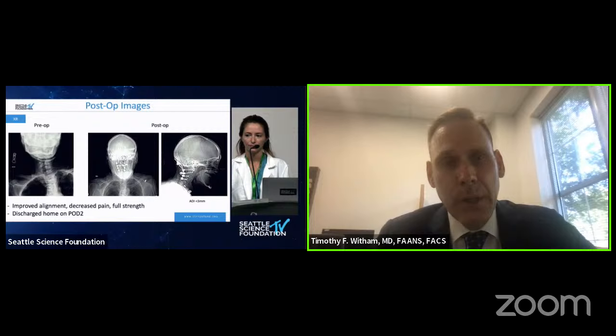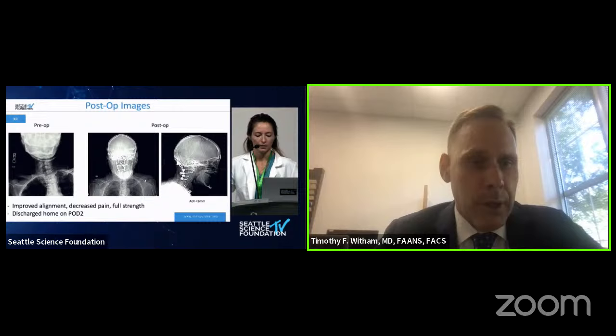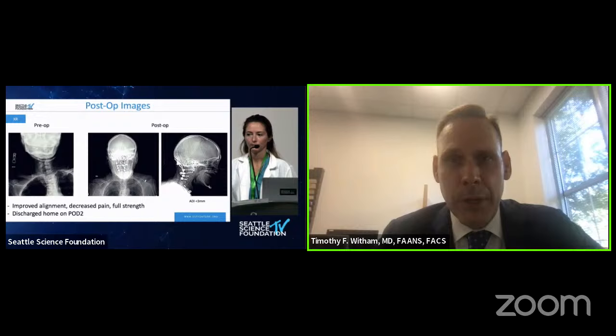And one question I would have for you, did you guys find that when you put the patient in traction that it reduced a lot of that subluxation prior to actually even really getting started? Because that's one of the things that I have sort of emphasized with our trainees, that you're always better off if you can get things lined up before you actually start the procedure. Now, obviously there are techniques that you can use intraoperatively, but putting the traction on may have been critical in this case. Tell me how you felt that was.